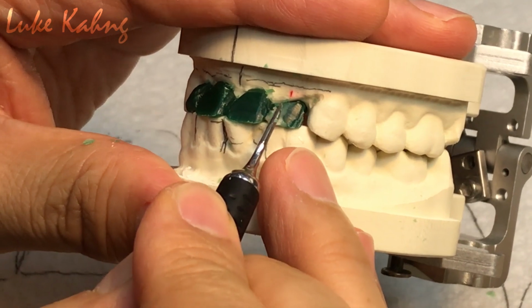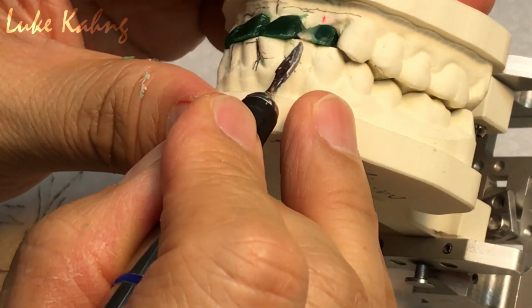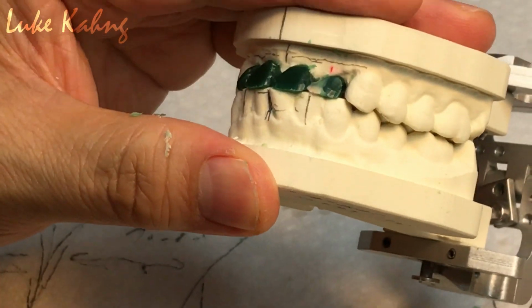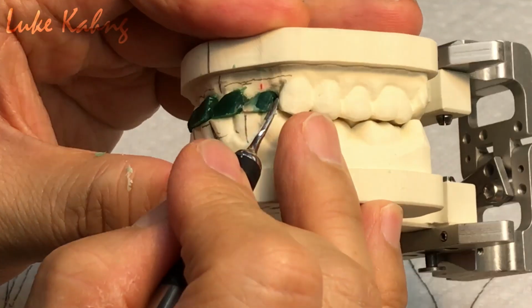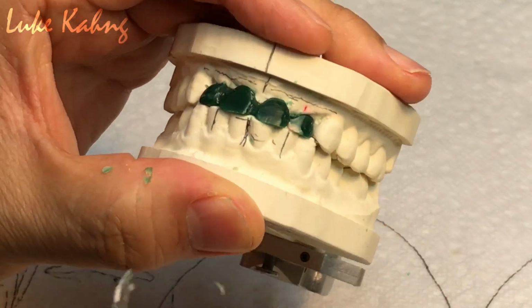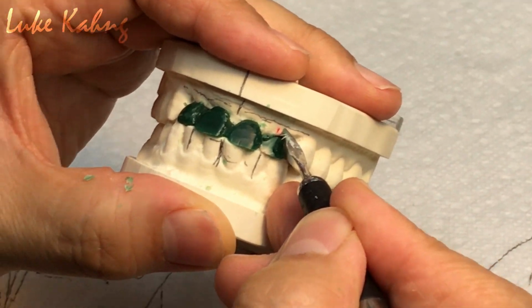And then make U shape like I told you. But I need support here better, then you won't get cracking. Right? Yeah, that's what I need. So this is what I call the special design. That's good. I can make this to here.